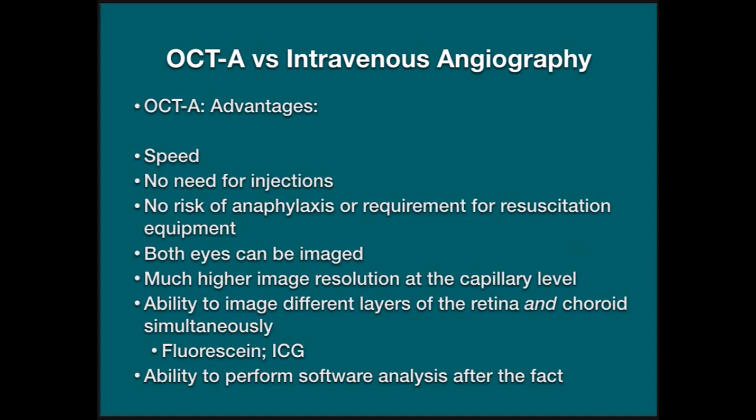Okay, how does OCT angiography compare with the traditional fluorescein angiography? The advantages of OCT is, number one, the speed. It's much quicker to take a scan of the eye, even if it takes a minute or two, than it is to perform angiography with dye. Obviously, there's no need for injections. In most jurisdictions, optometrists aren't generally allowed to perform fluorescein angiography, although I know some states they do permit that, but the majority aren't able to do that, so we don't have dye-based angiography available to us. There is no risk of anaphylaxis and no requirement to have resuscitation equipment at your clinic.